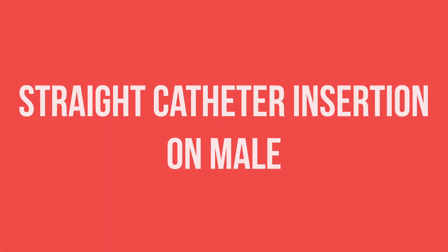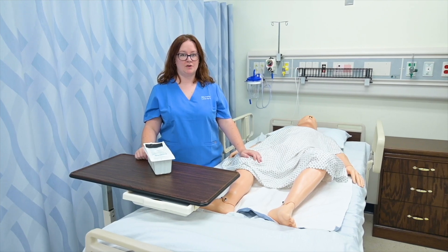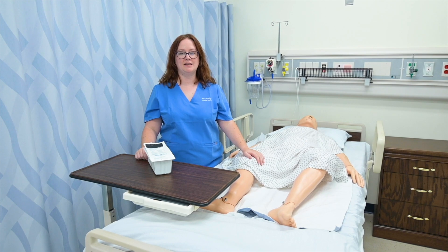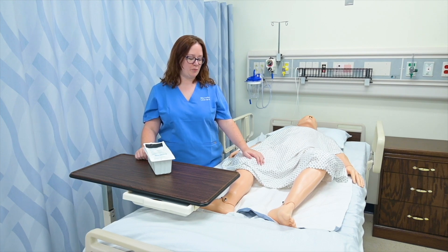So if you have the deck, go ahead and grab it and follow along with me. If you don't have the deck and you're interested in checking it out, pop on over to leveluprn.com. Before I can insert a straight cath into a patient who is male, I need to have positioned them in a supine position and done any perineal care that would be appropriate.